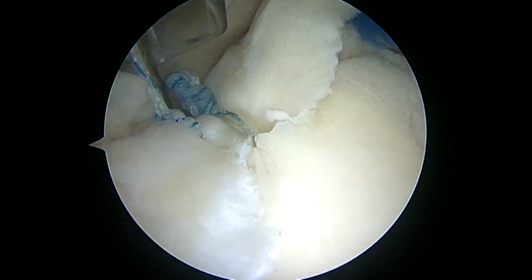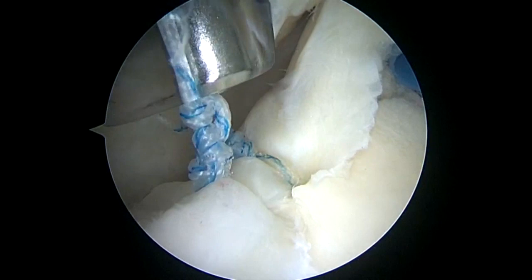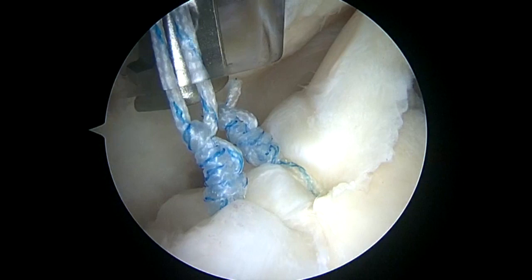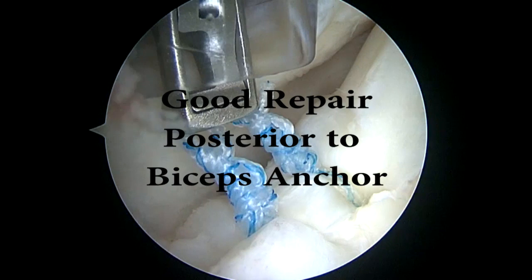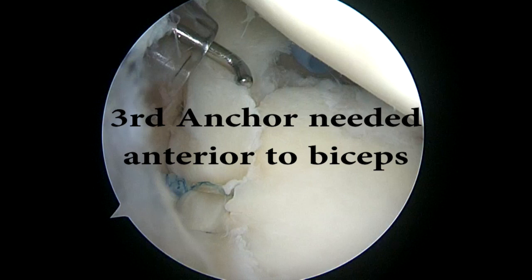The second knot is being tied down. The sutures are cut, and then I'll check the stability of the repair. We have a good repair posterior to the biceps anchor. Now I'm checking anterior where we need a third suture and anchor.